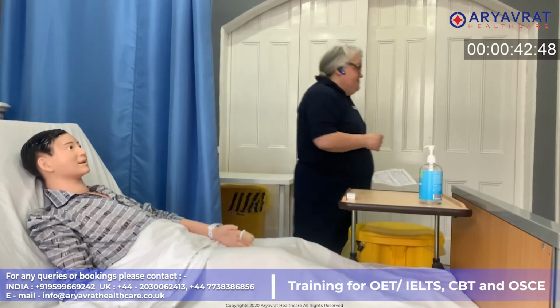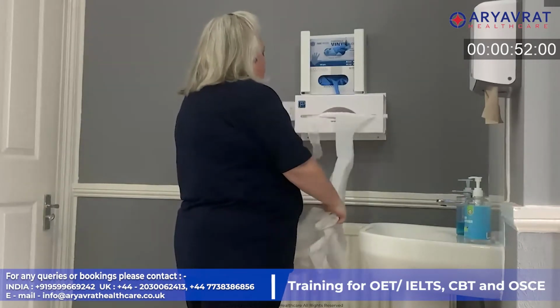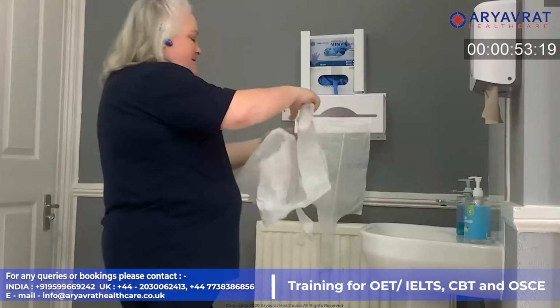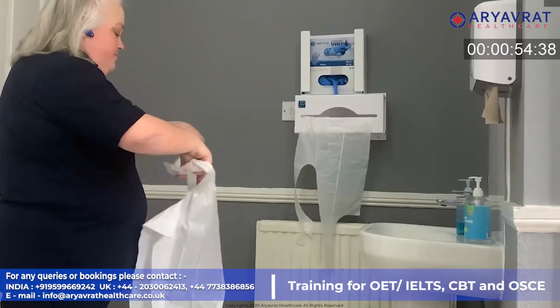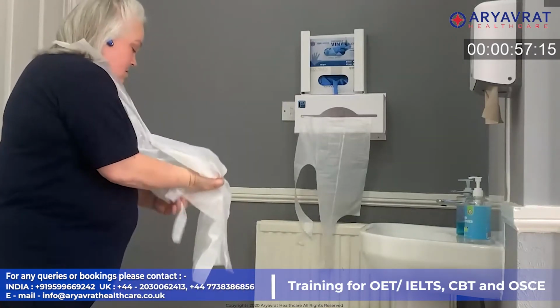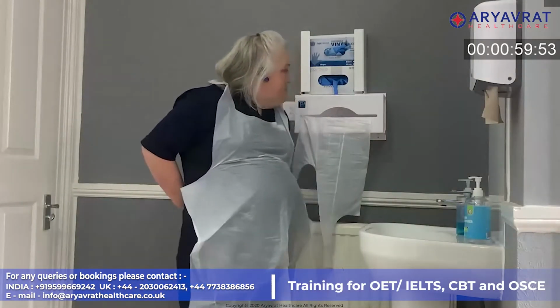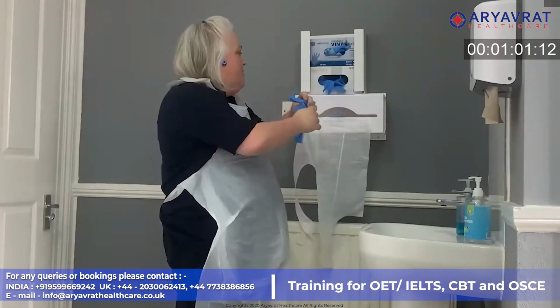Okay. I'm going to do my hand hygiene. I'm not washing my hands at this time. My hands are physically clean. If they weren't, I would use soap and water to clean them. Okay. And one pair of gloves.